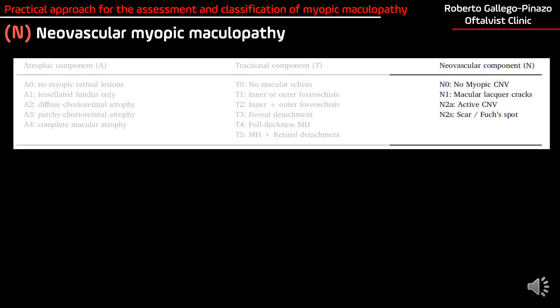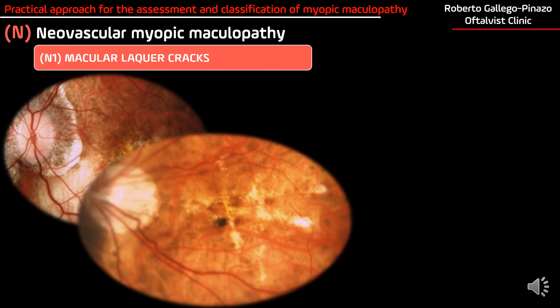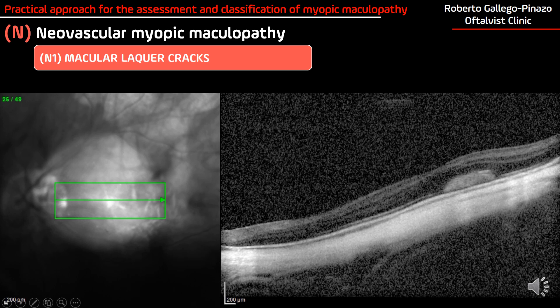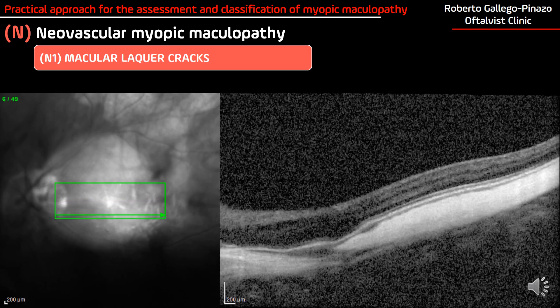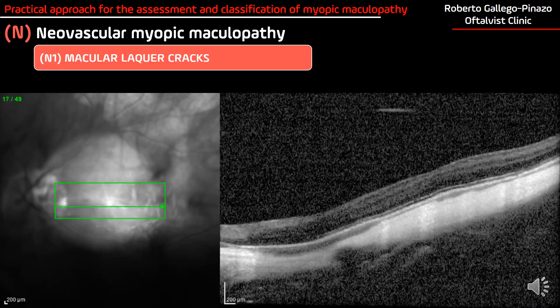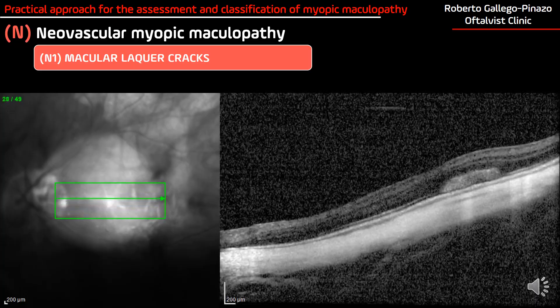Finally, we have the neovascular component of myopic maculopathy. First, with the presence of lacquer cracks — we should not forget that macular lacquer cracks are precursors of the development of choroidal neovascularization, and these patients may need to be followed up very closely. Here we can see a subretinal spontaneous hemorrhage in a highly myopic patient; in the OCT, the RPE is intact. Remember that macular lacquer cracks develop, in many cases, following a spontaneous subretinal hemorrhage.